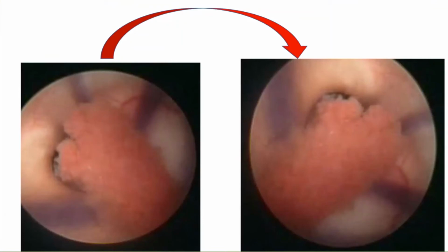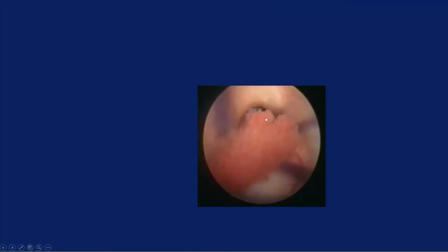Most of us, for most uncomplicated cases, especially in adult cases, will usually start off with a 0-degree rigid scope, so you don't have this problem. But in, for example, pediatric cases where you're combining this with choroid plexus coagulation, you'll inevitably have the flexible endoscope on hand too. Or if you have really small ventricles, or some other reasons that force you to use a flexible endoscope, make sure that the orientation is matched correctly.